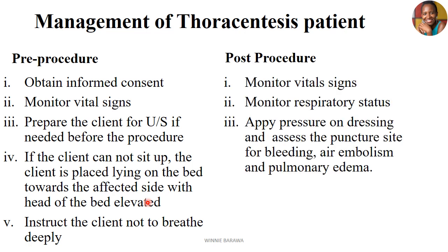For the post-procedure, it's a similar kind of management where you monitor the vital signs, that is respirations, blood pressure, pulse, and all that. But again, you need to be keen on monitoring the respiratory status, because this is a client who was on restrained respiration because of the fluid, and the lungs were being compressed.